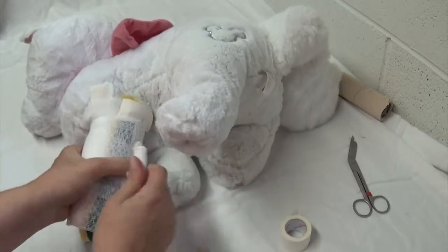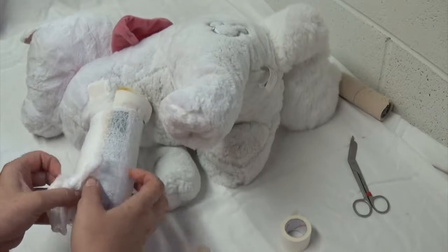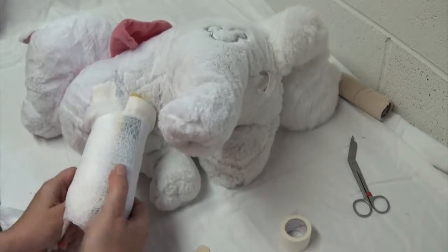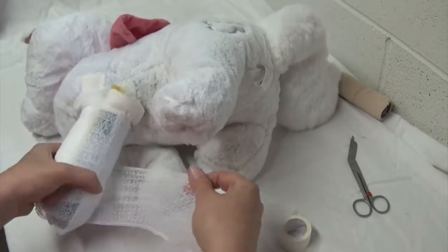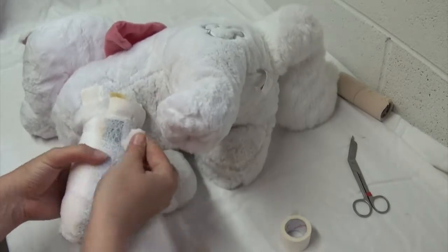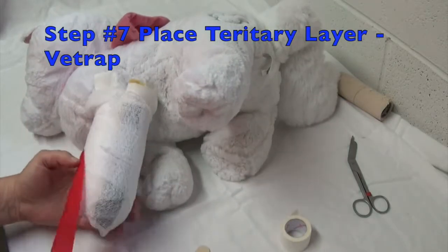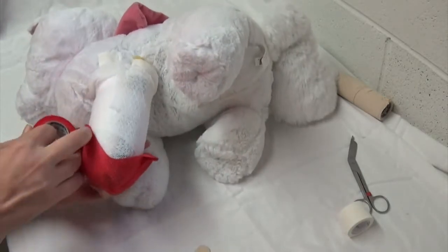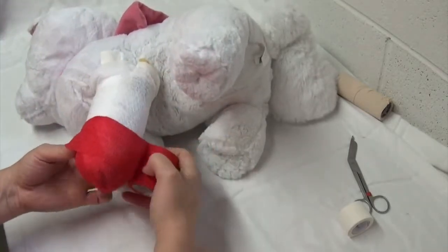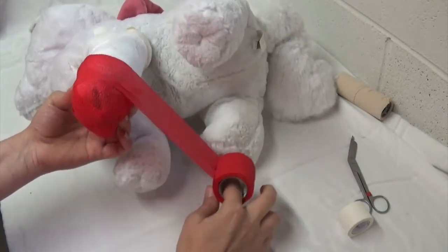Do a couple of passes. Remember, spoon splints are for the front limbs and for any fractures distal to the humerus. If the humerus itself is fractured, this won't work well because you need to immobilize the joint above and the joint below whenever placing a splint. I've included the toes in this bandage, so I'm going to take my vet wrap around the ends of the toes. Be careful about folding — you don't want to create any pressure sores, especially with a splint that's going to stay on for a while.